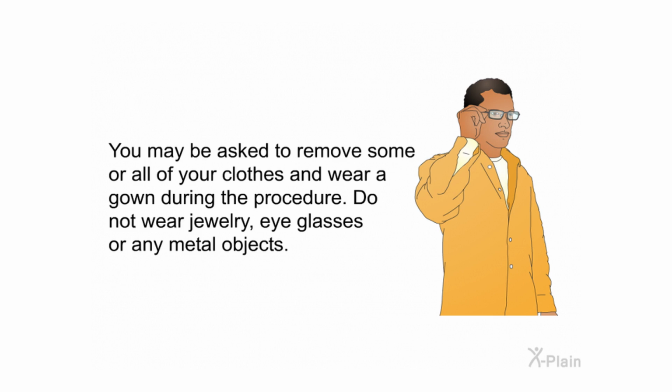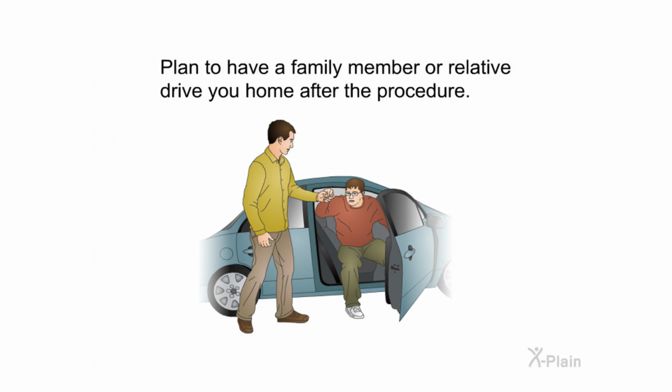You may be asked to remove some or all of your clothes and wear a gown during the procedure. Do not wear jewelry, eyeglasses, or any metal objects. Plan to have a family member or relative drive you home after the procedure.